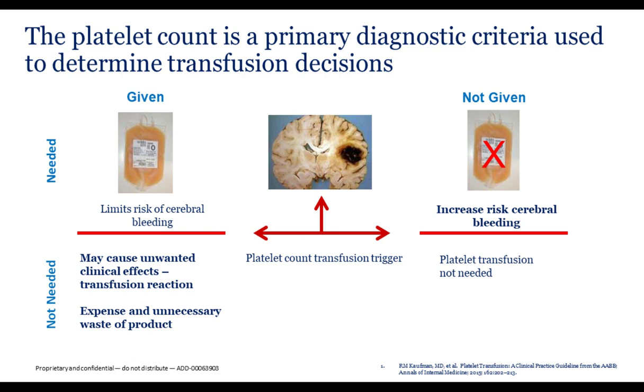If the platelet transfusion is not needed, it may cause unwanted clinical effects such as a transfusion reaction if they're given, again because of the erroneous platelet count being too low. And also the expense and unnecessary waste of platelet products, because we know platelets are very expensive and from an inventory standpoint also expensive to keep on hand. Obviously, if it's not needed, we have a good count, and it's not given, there's no impact on the patient care.